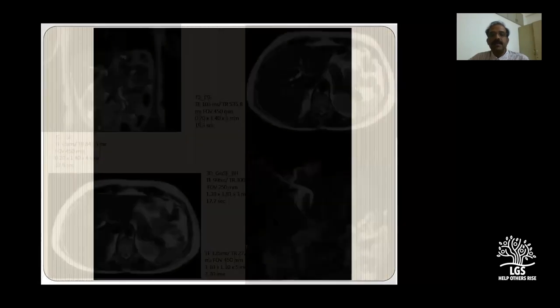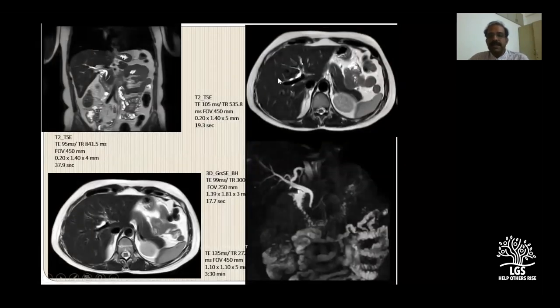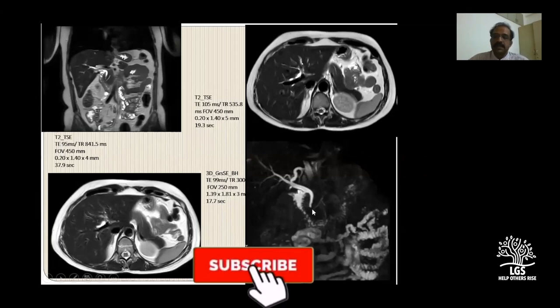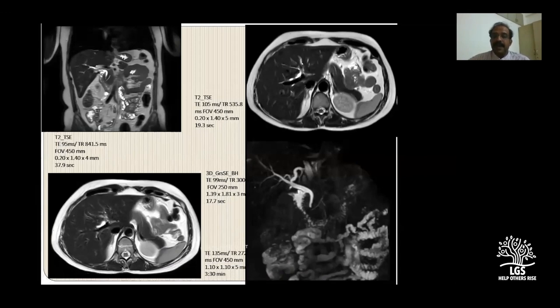MRCP sequences usually take considerable time - around half an hour on older scanners. With newer scanners we have a very fast imaging technique called compressed sense imaging. What used to take around six minutes is now done in far less time. This MRCP sequence took just 17.7 seconds, and the T2 axial and portal images took around 19.3 seconds. The image quality is exquisite. There is a big advantage - even if the patient is sick and cannot hold breath, we have good sequences to overcome these difficulties.